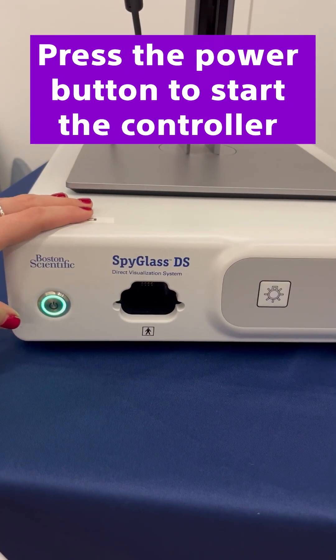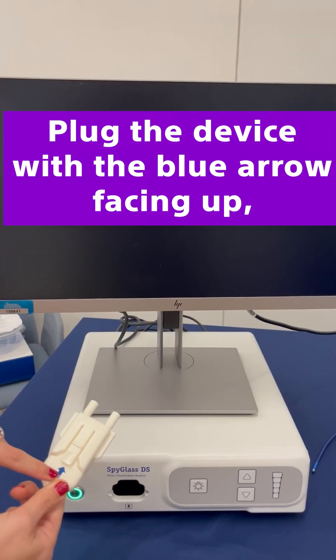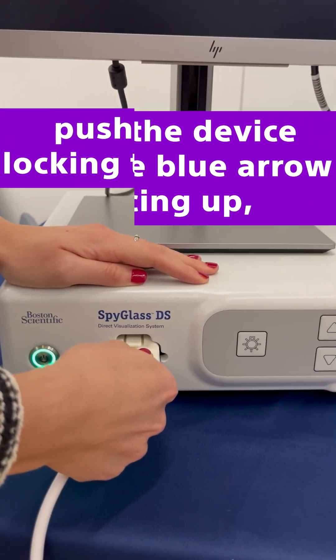Press the power button to start the controller and plug the device in with the blue arrow facing up. Push until the locking tab engages and the image is present on the screen.